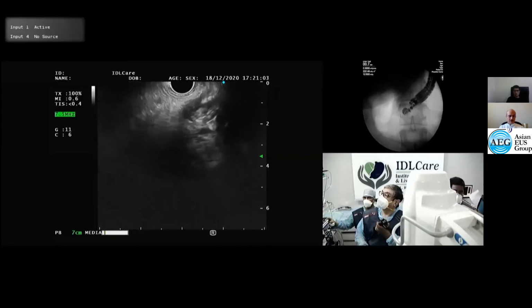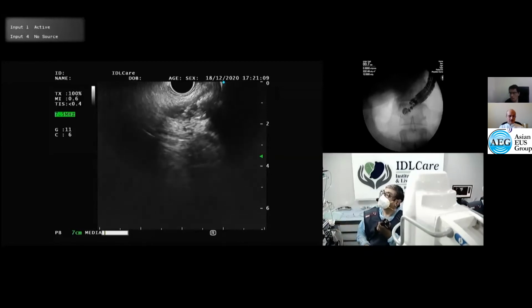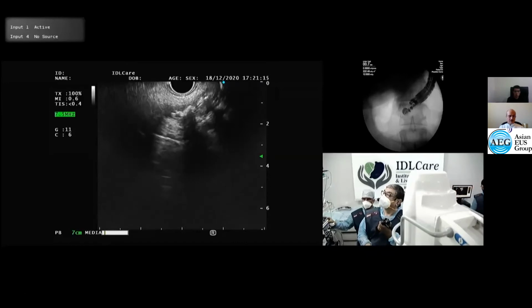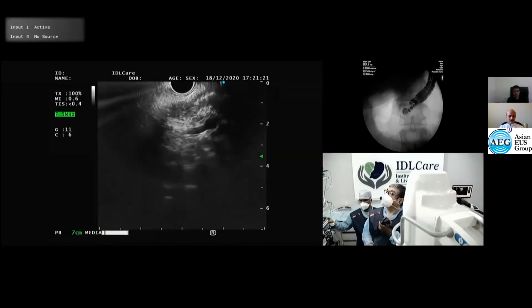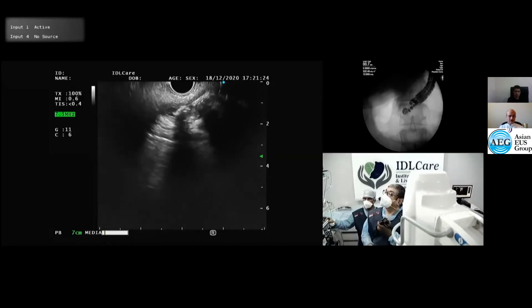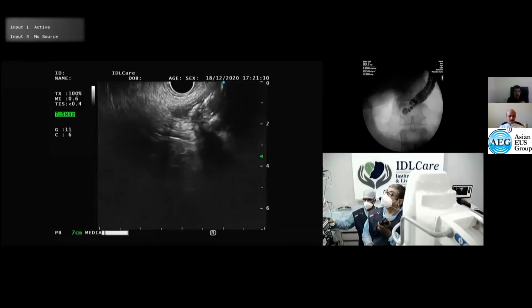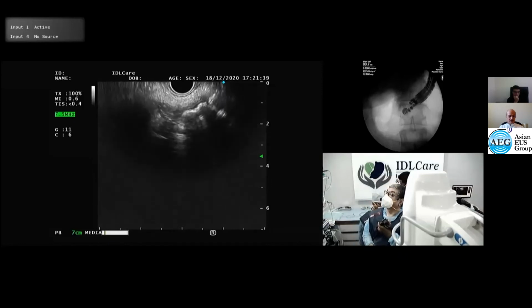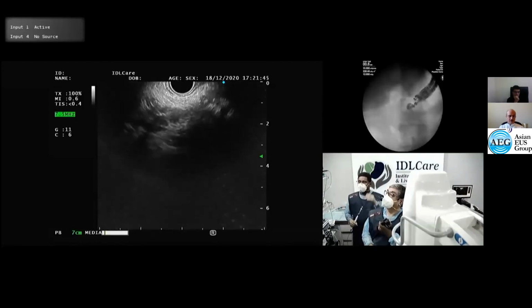Scope पकड़ना पड़ेगा. दीपक किधर है? Trying to get a good position so that I can puncture safely without creating much problems to the patient. पकड़ा? अरे अरे अरे क्या कर रहे? हिल गया पूरा. Fluoro once again. Or patient is very unhappy. CO2, CO2.